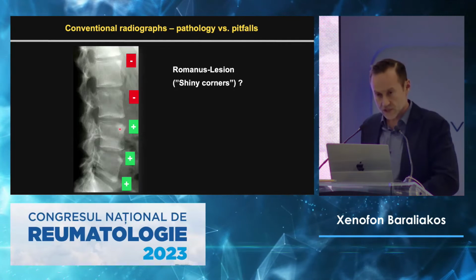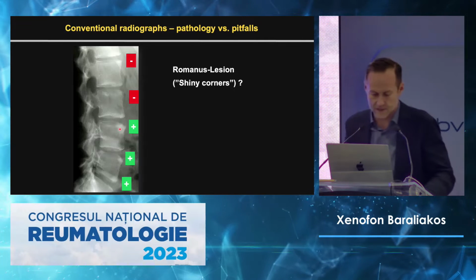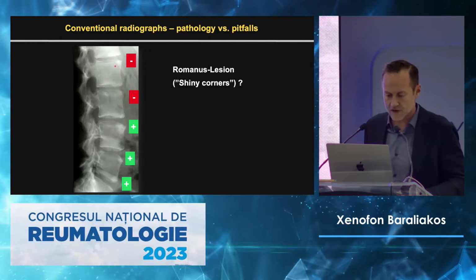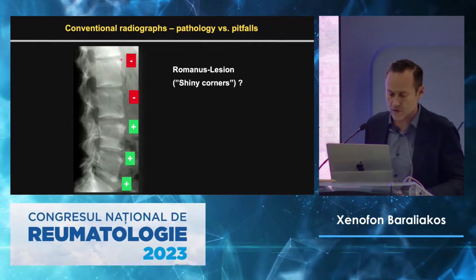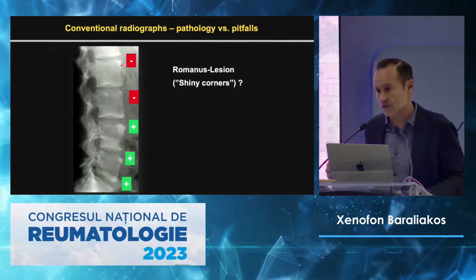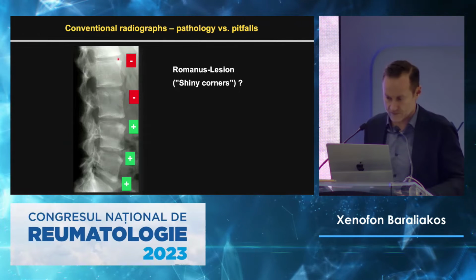So altogether, pay attention. That's the main essence of this slide. We look at the edges. We look at white spots. We look at hyperdense lesions, maybe with or without erosion. But especially there in the upper part of the lumbar spine where you have the ribs, there is a lot of bias, there is a lot of false positive findings because of the overlay of the ribs.